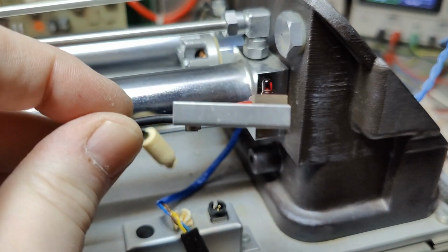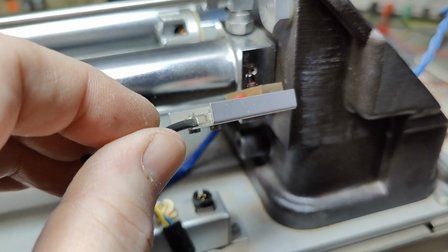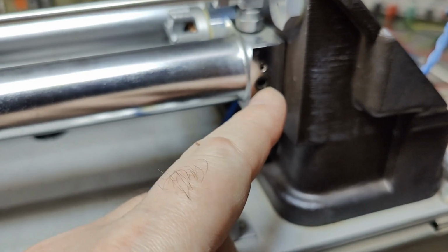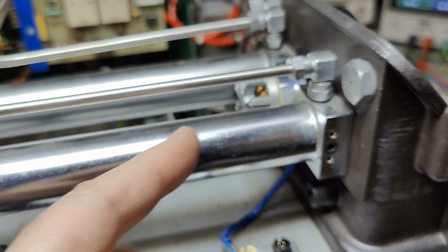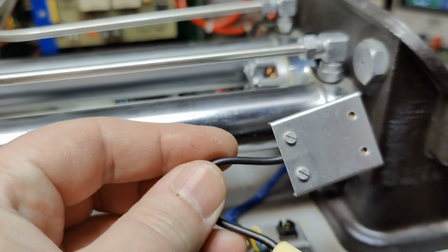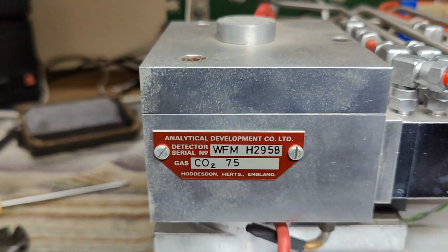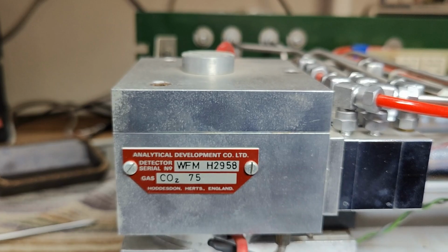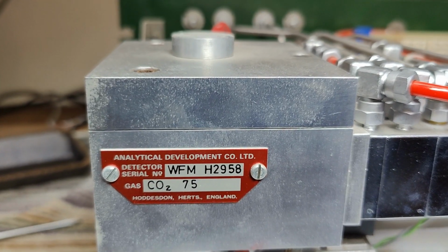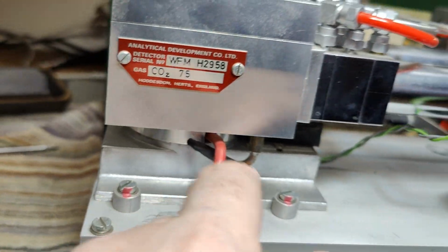Interesting. So here's a little interesting thing that I found. In one of the sides, there's a tiny little dark red LED. So this one will shine a little bit of light in here and create a tiny little calibration signal, probably, right? And here we go. This is a CO2 gas thingy. Yeah, I definitely want to have a little look at what is going on here.